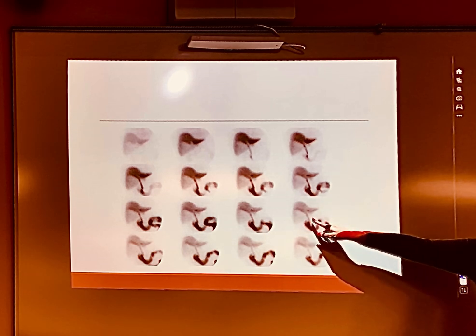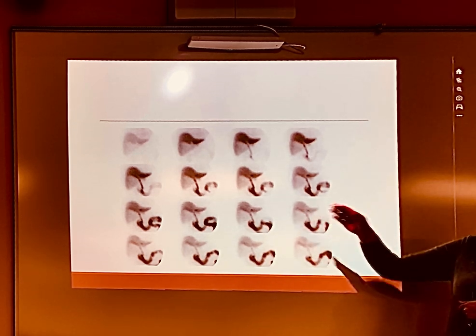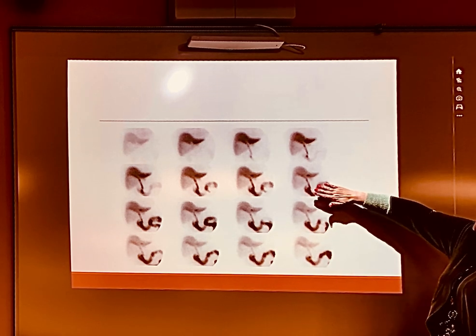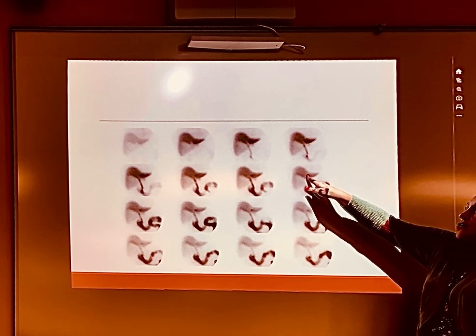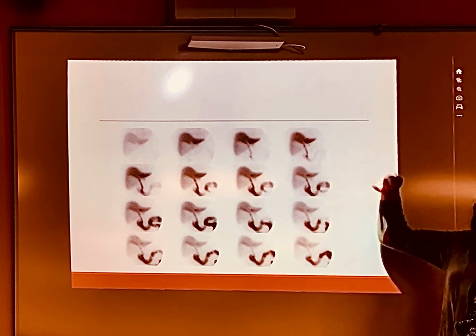Morphine works when you still have a lot of activity in the common bile duct, because it'll shoot it back in there. But once it goes all the way to the duodenum, it won't push it that far back up the biliary tree. If you had this much liver, they probably would, because you still have a lot of activity in your intrahepatic ducts, and that'll push it the other way.